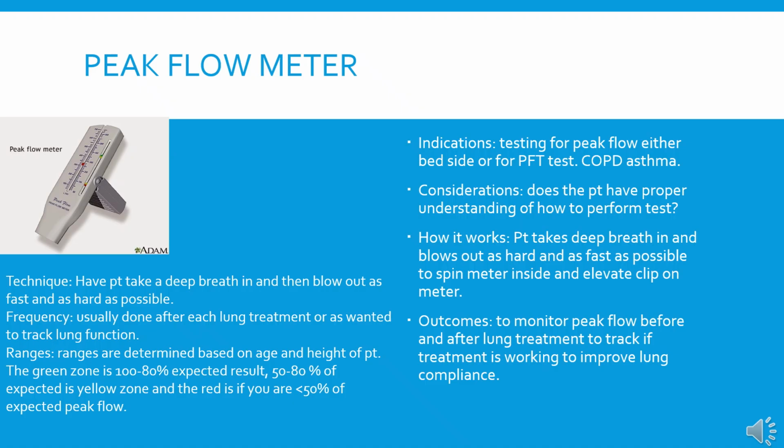Indications: testing for peak flow, either bedside or PFT test, and this would be if somebody had COPD or asthma. A couple considerations is, does the patient have proper understanding of how to perform the test? Very important for the peak flow test. And a couple outcomes is to monitor peak flow before and after lung treatment to track if treatment is working to improve lung compliance.